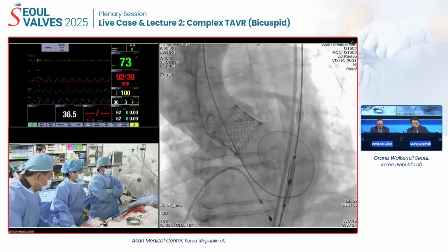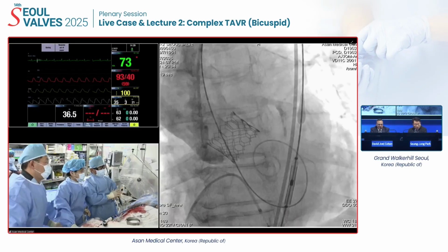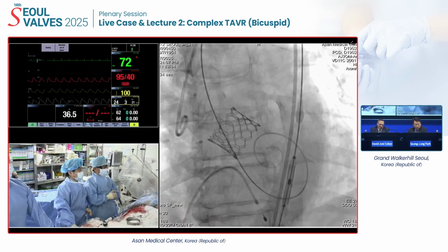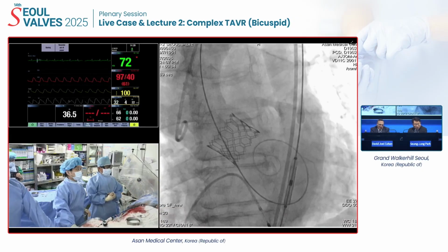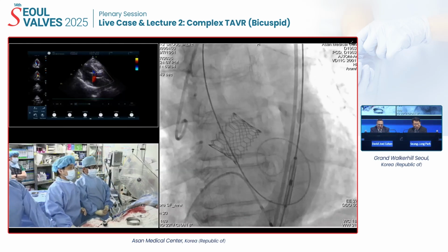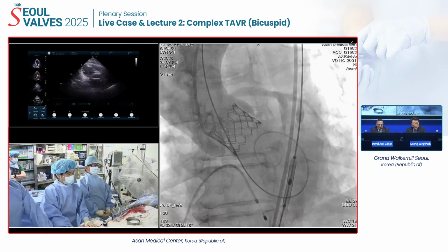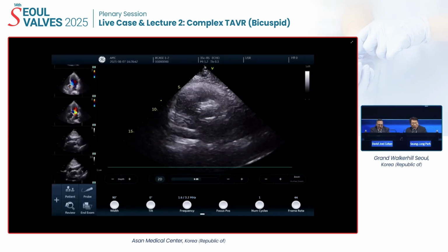Mainly central. For bicuspid aortic valve disease, our sizing is totally dependent on the aortic valve calcification. In this case, with very low aortic valve calcification, it is similar to the treatment of tricuspid aortic valve disease. So what is your usual oversizing in tricuspid aortic valve disease when you use the SAPIEN 3, Cohen, David?